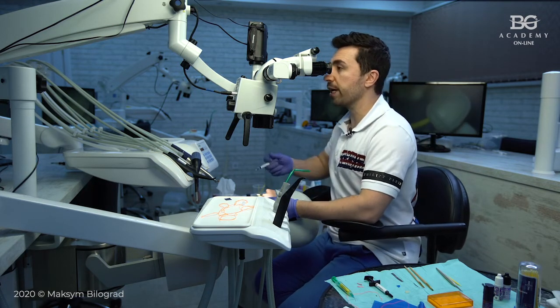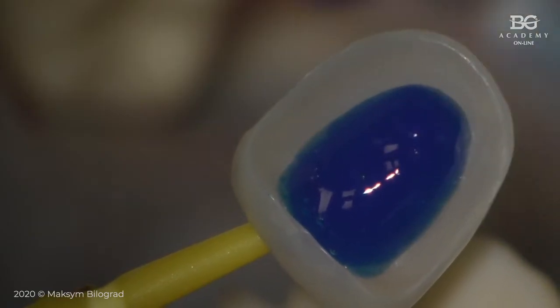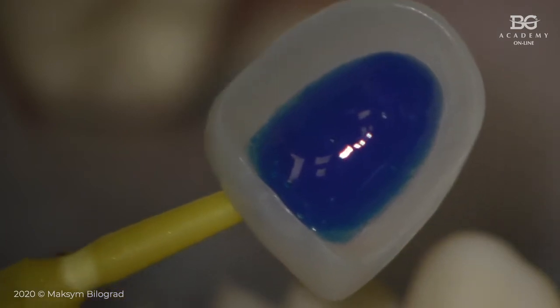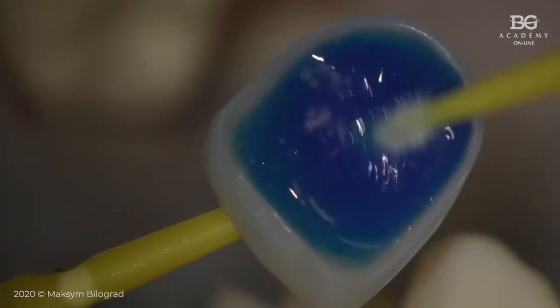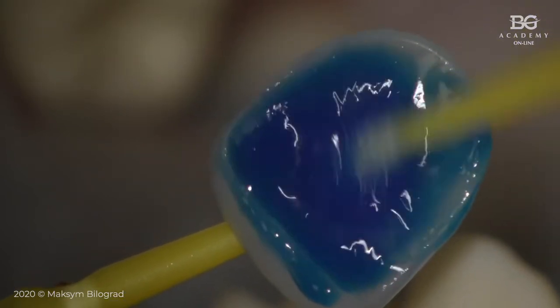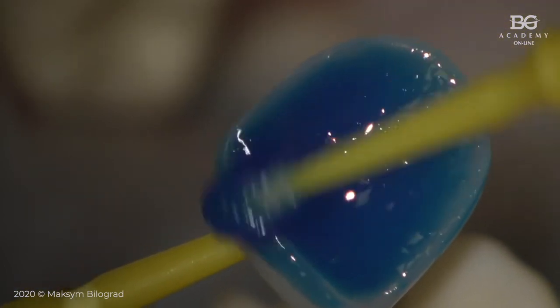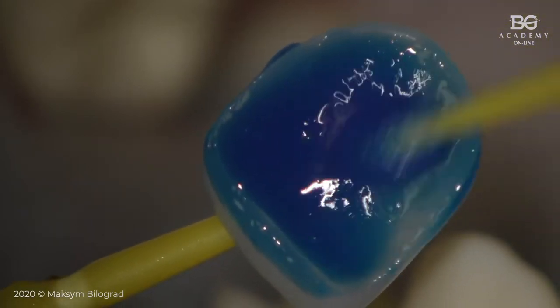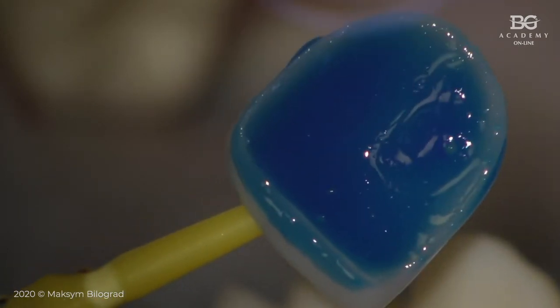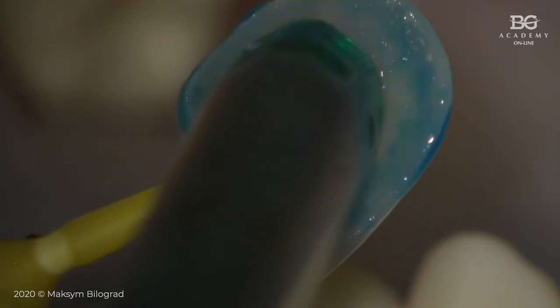You can just take phosphoric acid, the one that you are using for preparation of tooth surface. Okay, we use phosphoric acid. With a microbrush, we spread the phosphoric acid all over the surface, but in this case we have to make some activation. So with a microbrush, within 30 seconds, we will make some activation, massage. After this, we will rinse and dry, and then we're ready for silanization.